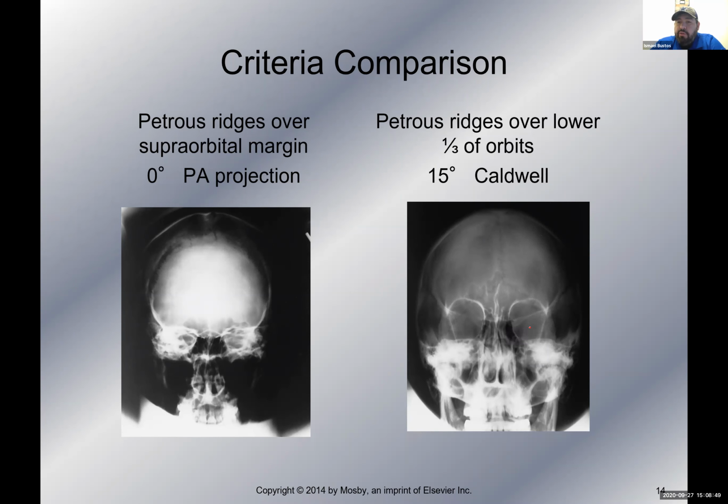So there was too much angle. Or, what else could cause the ridges to go low? Too much extension.